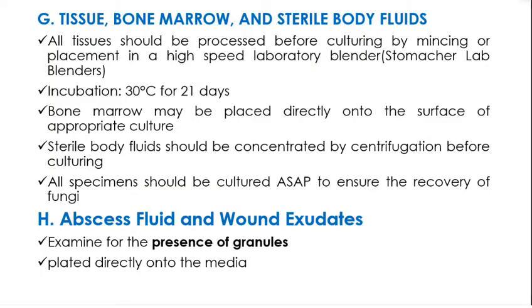So with the tissues, bone marrow, and sterile fluids, usually ito sa histopath. Pag tissue, meron munang kinuha na sample through surgery. You have your bone marrow and still your sterile body fluids. Same with your histology. Paulit-ulit lang sa mga subjects ninyo na nangangailangan ng specimen. Pag abscess naman, paano kinokollect yan? Or meron kayong wound exudates, paano kinokollect?